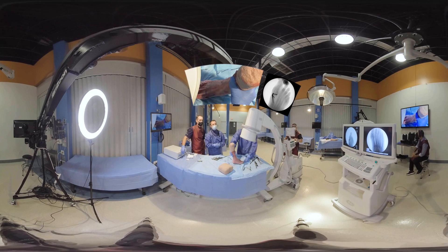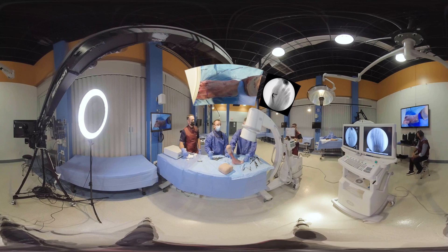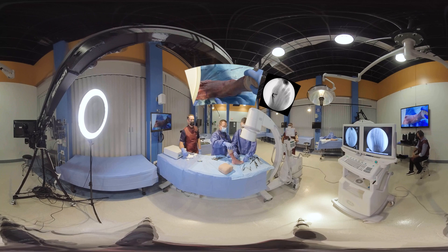So now we can see that it's translated, we got the rotation correct, it's locked with the implant. Got the soft tissue balancing — all through basically a medial one-inch incision without interrupting the capsule other than maybe the lateral capsule release.